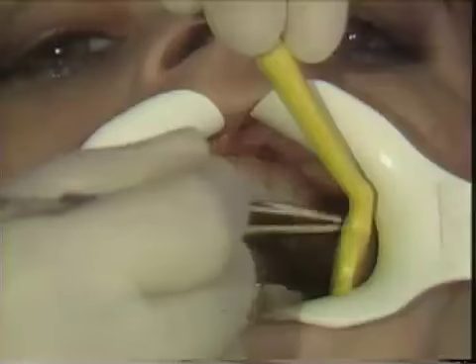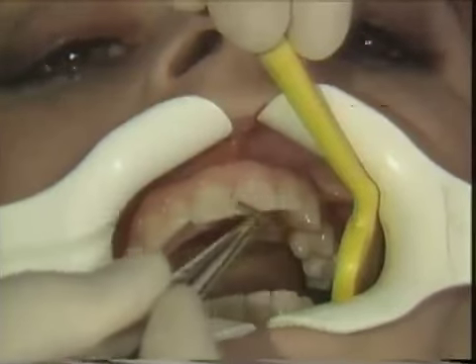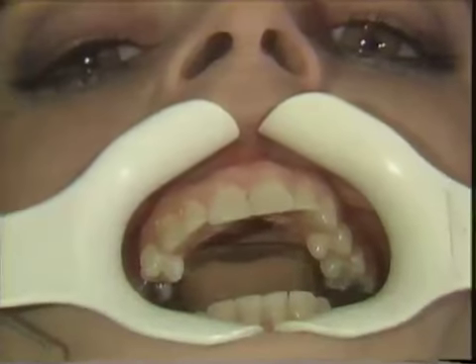And the only difference really between a liquid etch and a gel etch, of course, is the body of the material. The gel etch would have no run whatsoever into the gingiva. A liquid etch has to be controlled a little bit more.